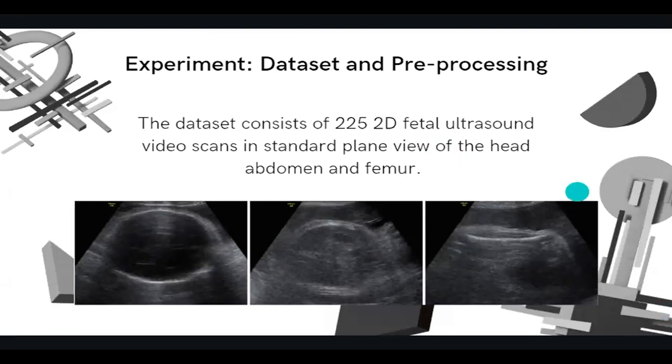Each ultrasound is captured in 2 resolutions, 960 by 720 and 852 by 1136. And the number of frames is between 463 and 1448, with an average of 852, and the FPS between 24 and 37. And as the ground truth, they used the true weight of the baby at birth, and these values were between 2,085 and 4,995 grams, which is about 4.6 pounds to 11 pounds, which I previously mentioned that those other methods didn't use as the ground truth. They didn't use the true weights.